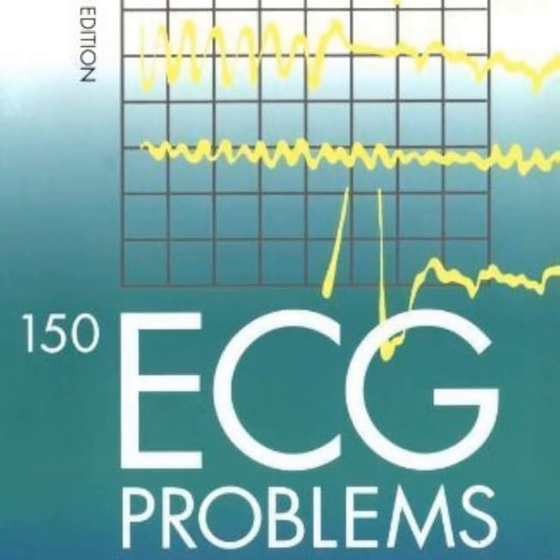Before you clock into your next shift, consider this scenario. You have a patient presenting with a broad, complex tachycardia, very similar to the post-MI ventricular tachycardia we just discussed. But unlike that crashing patient who required immediate cardioversion, this patient is sitting comfortably. They're fully conscious, with a blood pressure of 130/80. So they are hemodynamically stable, but they are in VT.